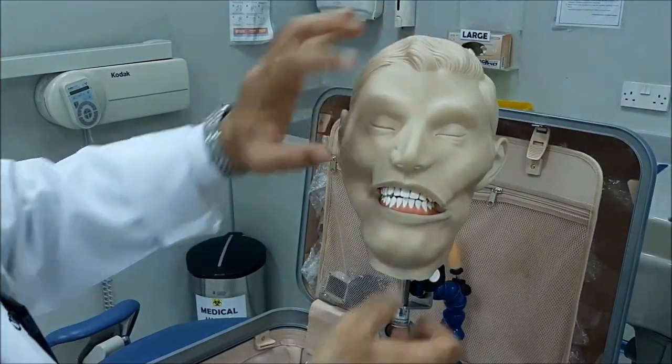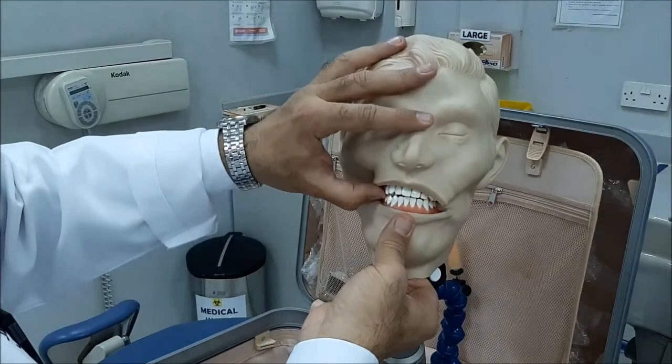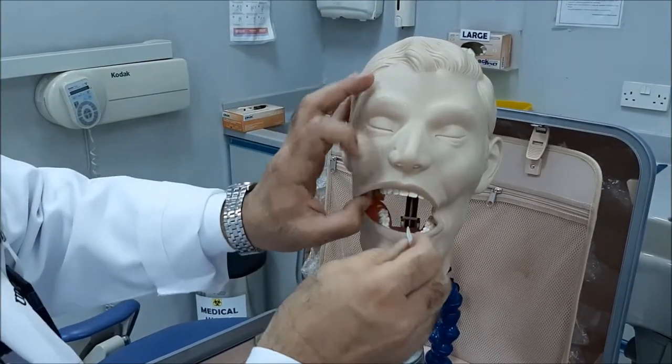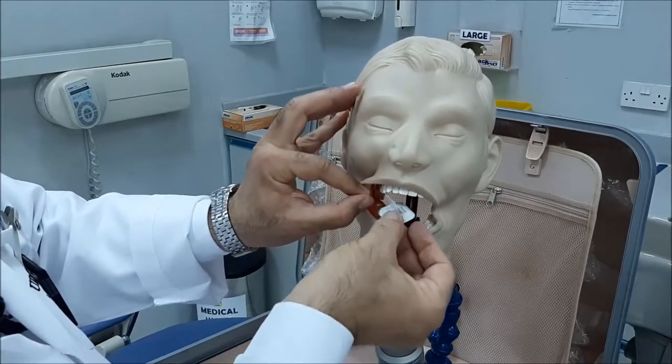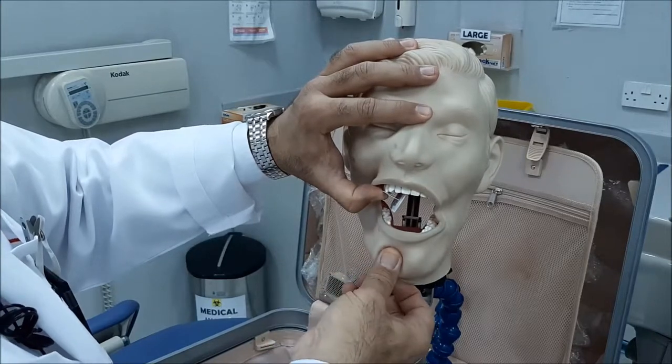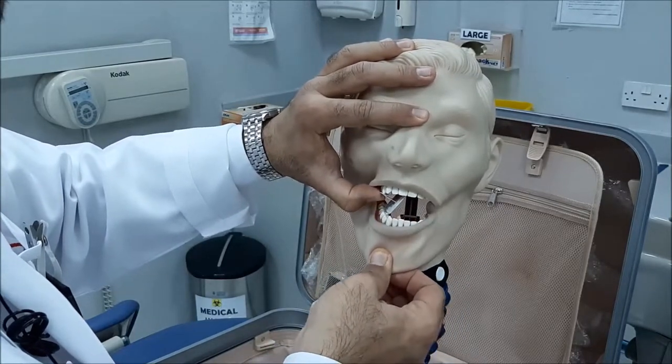I'll try to open again — when you open, it fell down. Again, I'll repeat. Backwards, premolars in the middle, put it on the upper jaw because it is fixed, and ask the patient to bite.